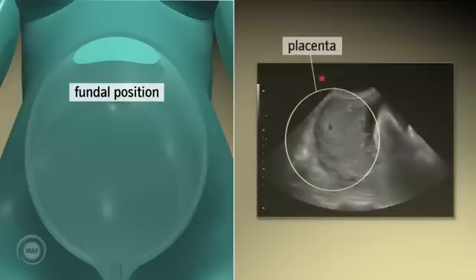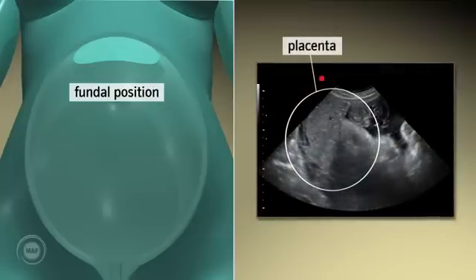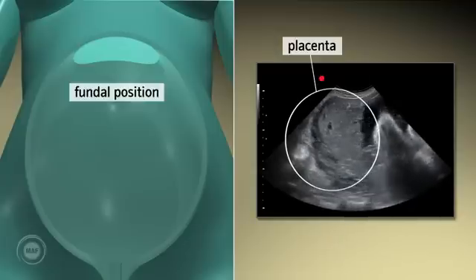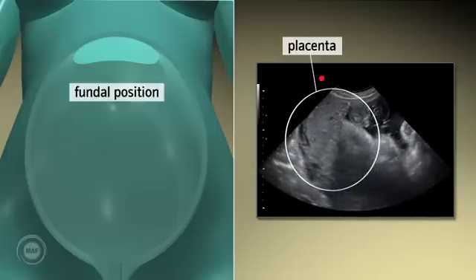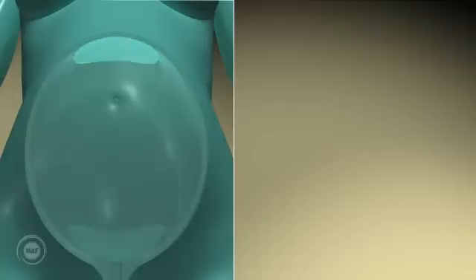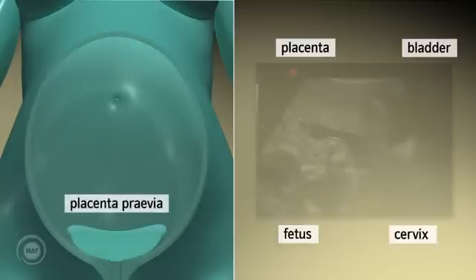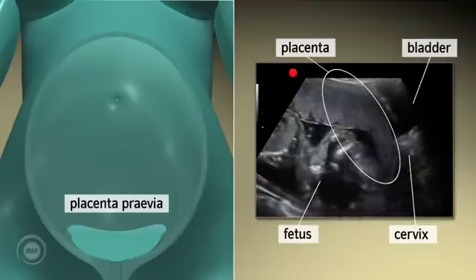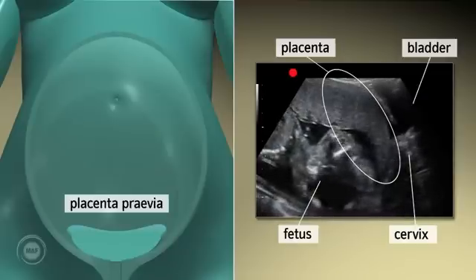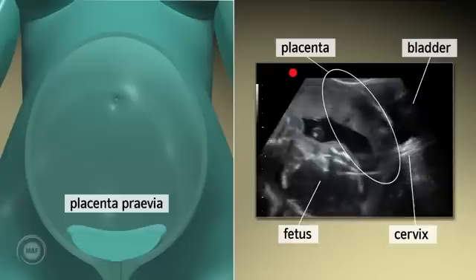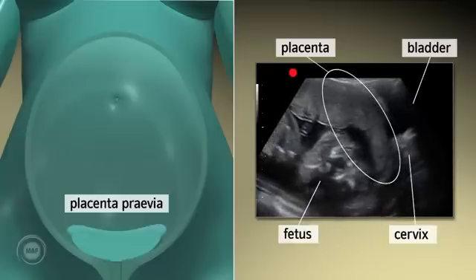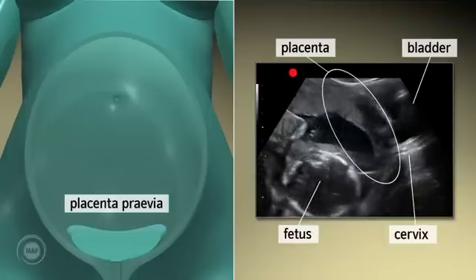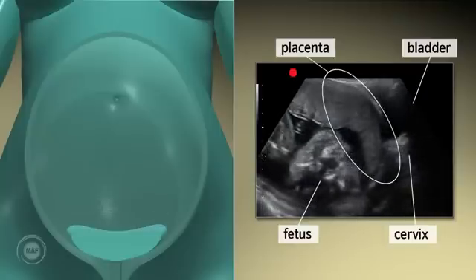Fundal position. Scanning in the longitudinal plane, the fundal placenta will be displayed on the left side of the screen. Placenta previa. Scanning in the longitudinal plane, the previa position will be shown on the right side of the screen. A low anterior placenta will appear between the bladder, which is seen at the extreme right of the screen, and the fetus on the left.